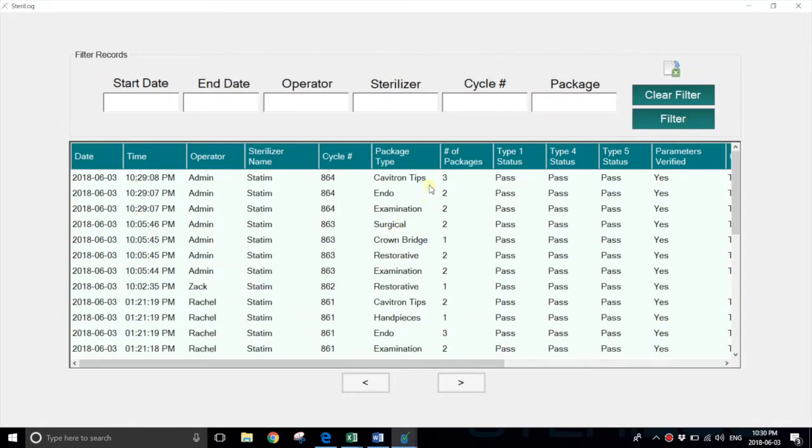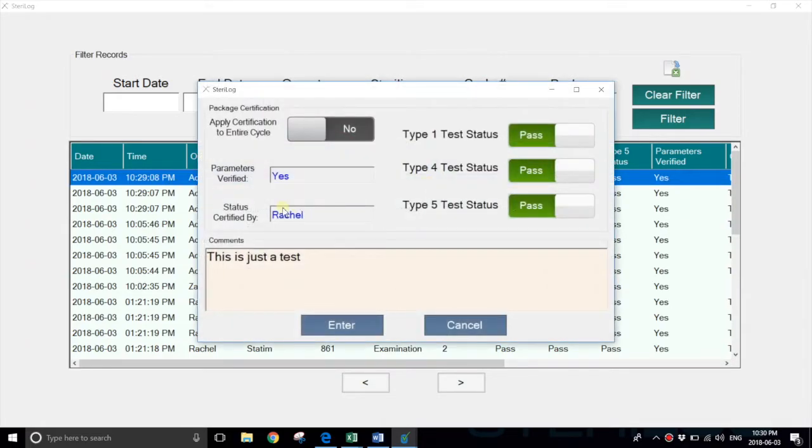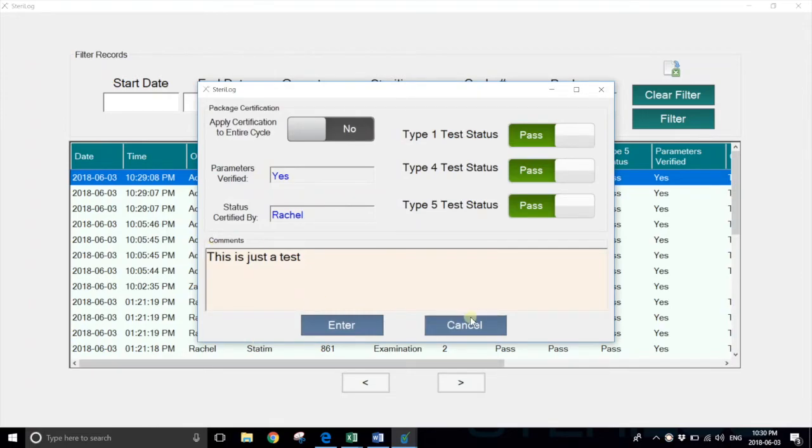Now when we select any particular package from the cycle, you'll see that it's been signed off with Rachel. You can see that the parameters of the sterilizer have been met, and you can see any comments associated with the cycle.